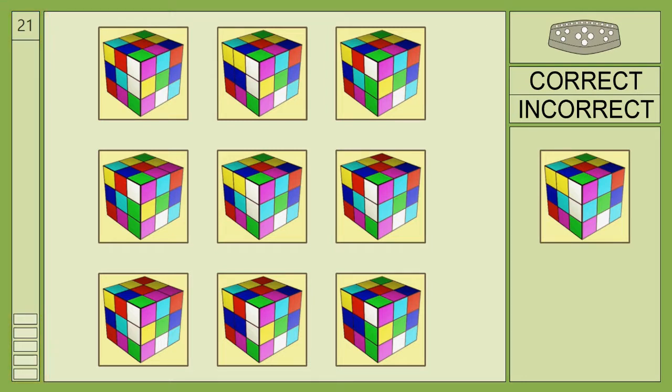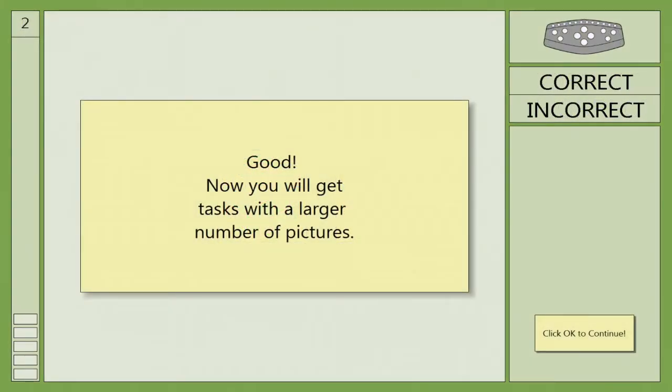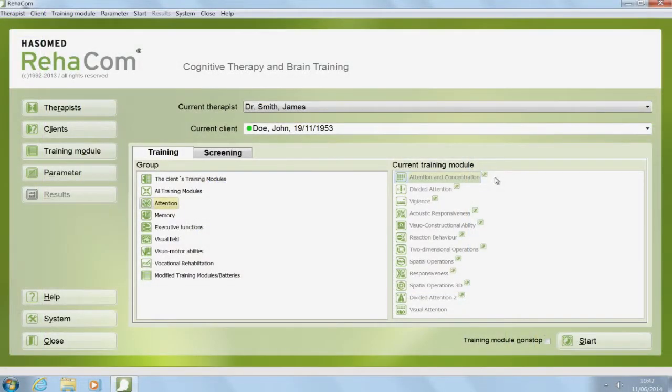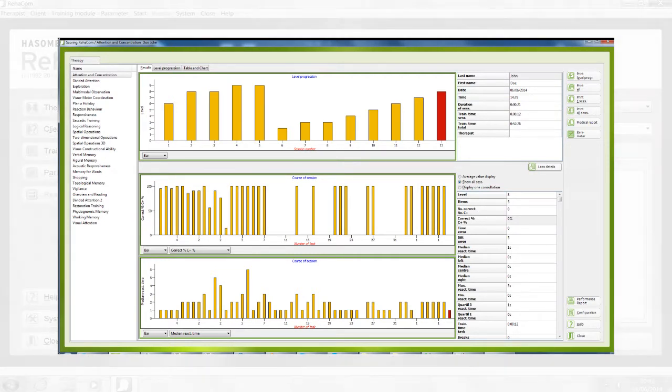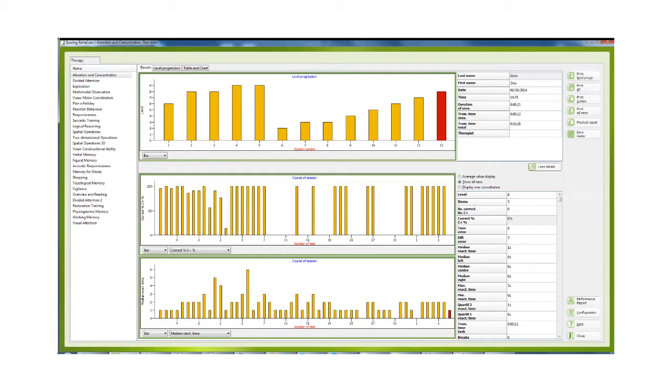At the end of a training session, Rehacom will create an evaluation graph. Training results will always be saved automatically, and the patient will then continue from this stage when starting the next training session.